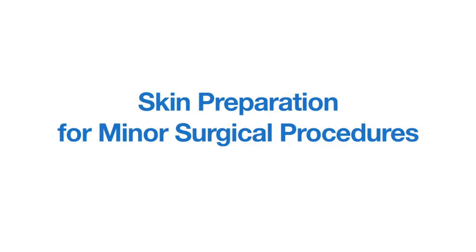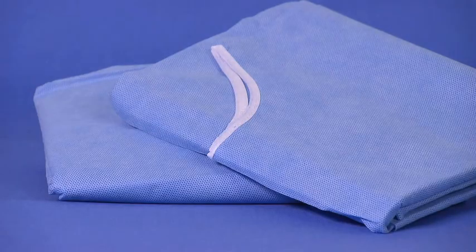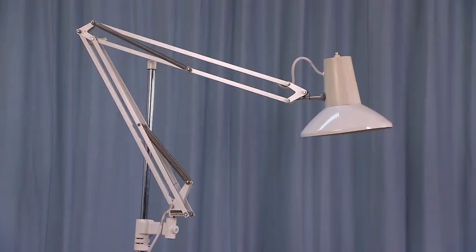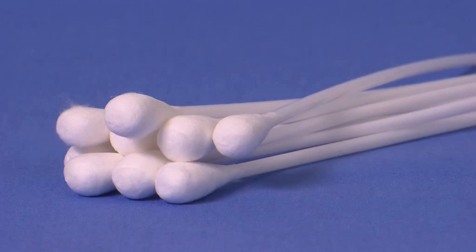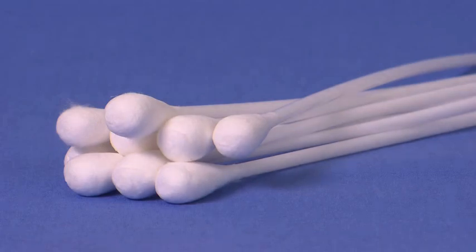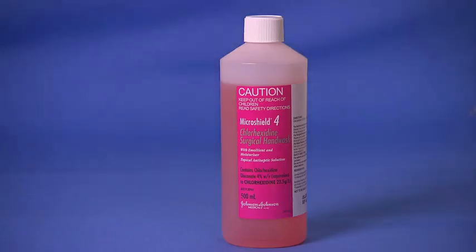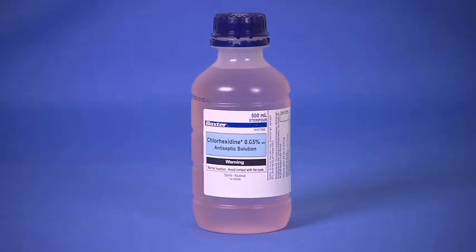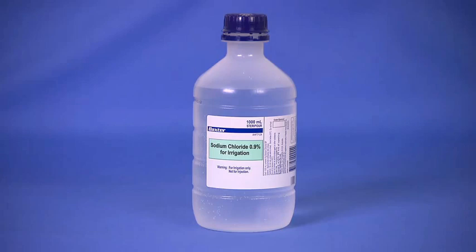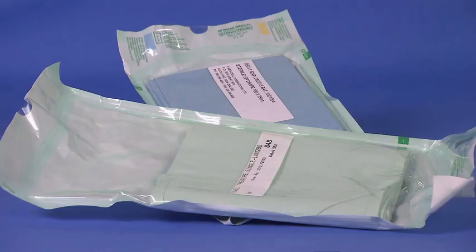Equipment required includes the following: sterile and non-sterile gloves, a patient gown, a directional light source, a skin preparation kit which may include gauze swabs, large cotton-tipped applicators, small sterile bowls and a drainage basin, antiseptic soap, antiseptic solution such as povidone iodine or chlorhexidine, and sterile saline solution if not included in the kit. Add any further supplies required such as cotton balls, sponge, transfer forceps, or sterile drapes.